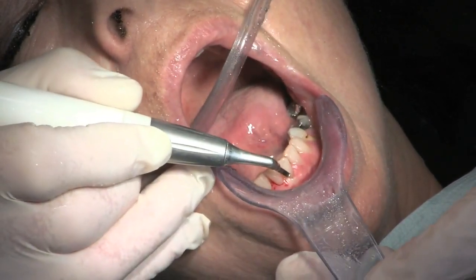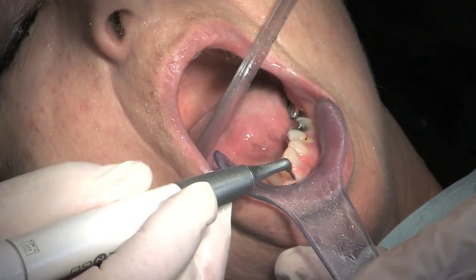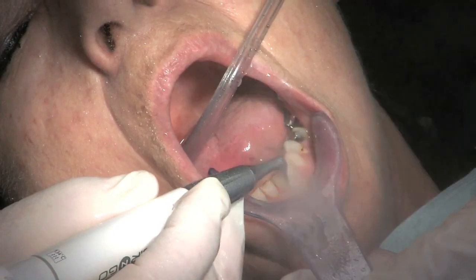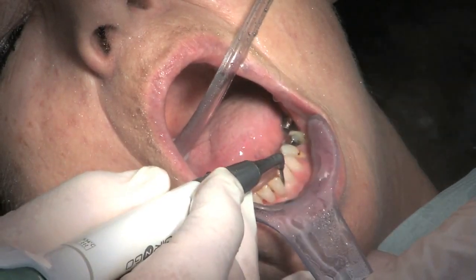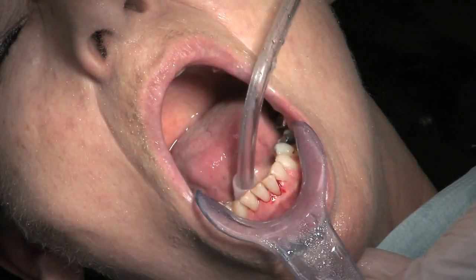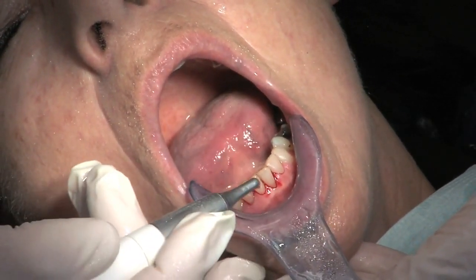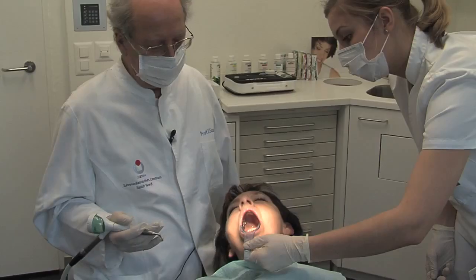Insert it again, enter into the pocket, turn around here. Remember this was a pocket of about 5 mm here. We go a little bit up and downwards. You see the small bleeding points — this is normal. We have a detached epithelium in the pocket. And I treat this also a little bit on the margin, so we get complete healing of the gum.